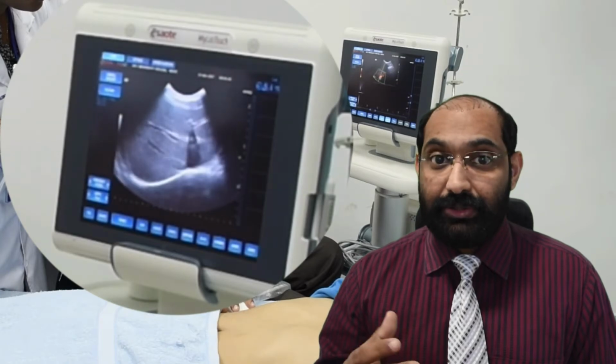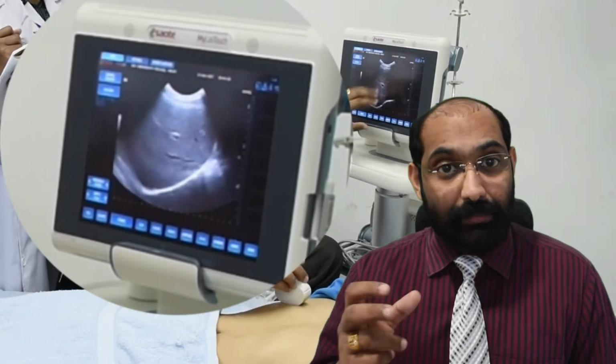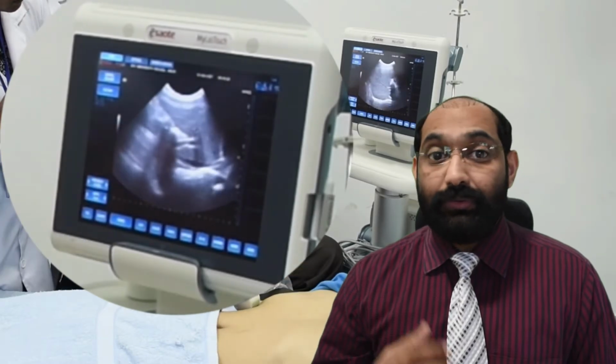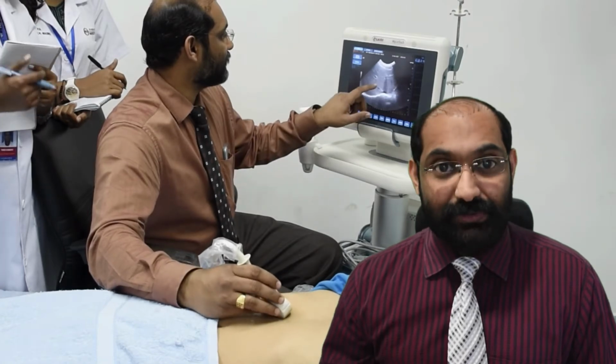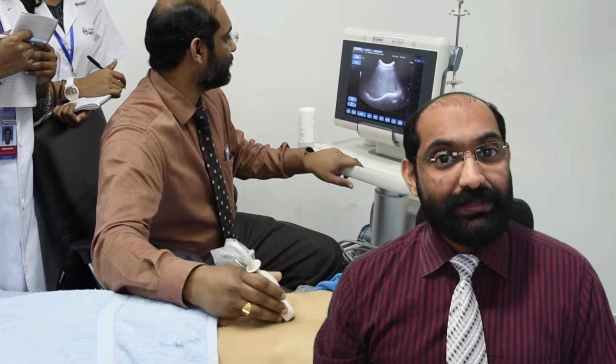As I said earlier, the transducer consists of an extensive array of crystals, which makes a series of image lines that come together to form an image frame, which is known as a sonogram. Furthermore, all the crystals are activated several times in a row, forming a complete image frame, roughly around 20 frames in a second, displaying a real-time moving image. That's the general idea about the ultrasound scanning systems. The ultrasound scan is cost-effective, harmless, and of good diagnostic value.